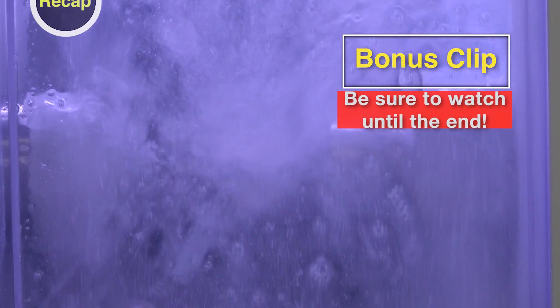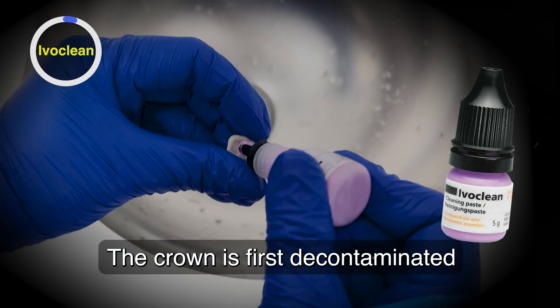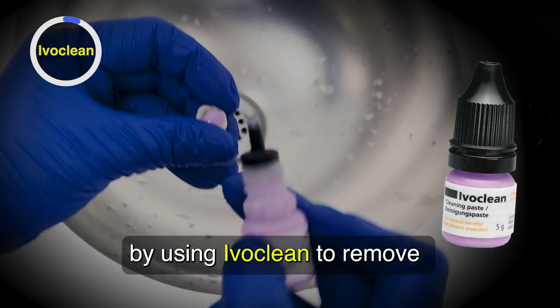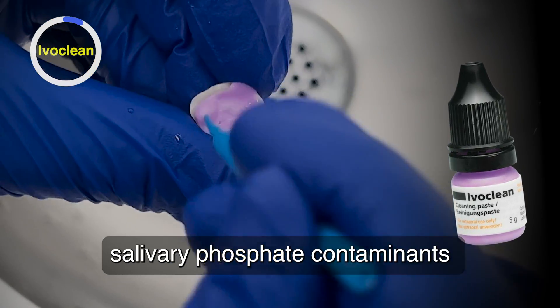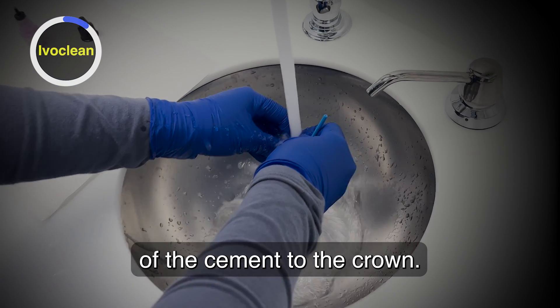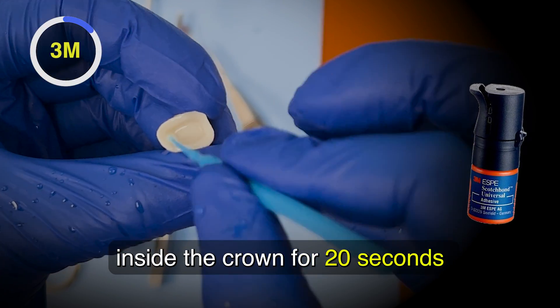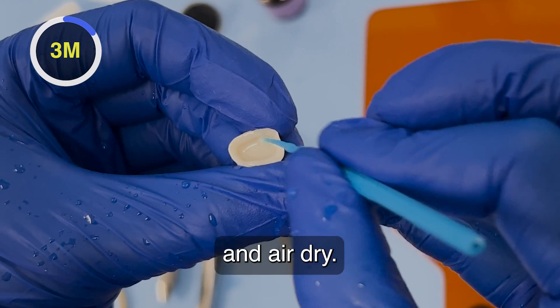In about 40 minutes, a fully-sintered Bruxer Now crown is made. The crown is first decontaminated using Ivoclean to remove salivary phosphate contaminants that can impede bonding of the cement to the crown. Scrub in 3M Scotchbond Universal inside the crown for 20 seconds and air dry.